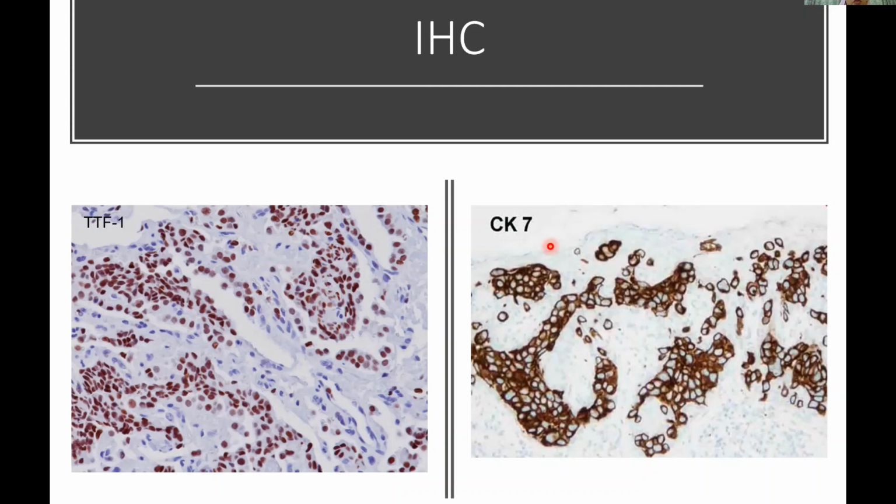For each tumor, for example colorectal, CK20 positive and CK7 negative, we have further staining to confirm colorectal. CDX2 is normally positive in colorectal cancer. So we decide based on the case. In our case, we did CK7, and it was positive. Then we proceeded with TTF1. TTF1 is a marker for lung and also thyroid.